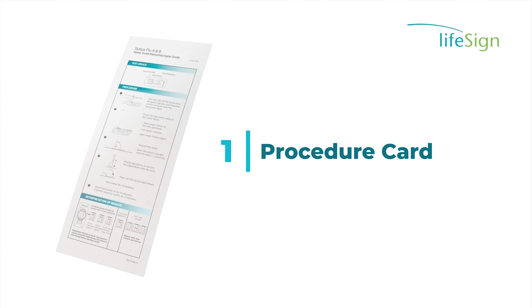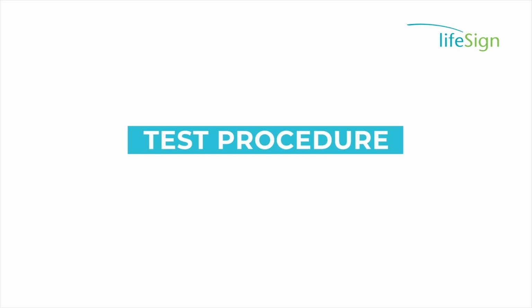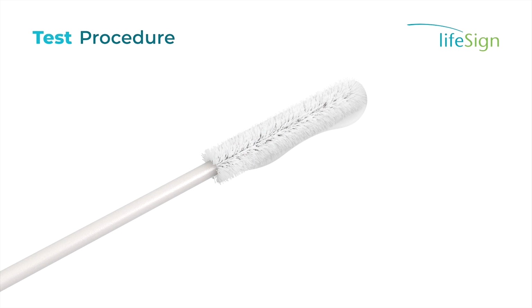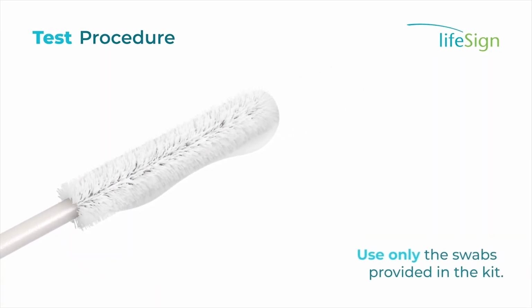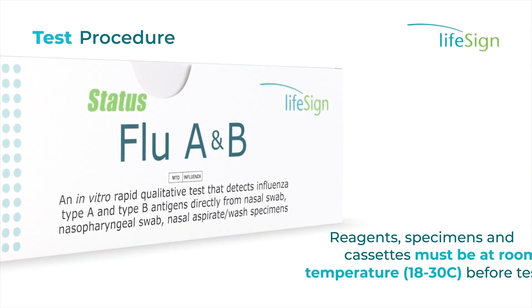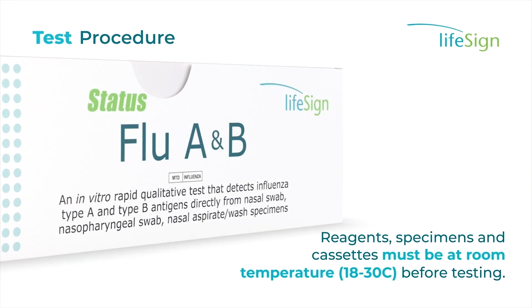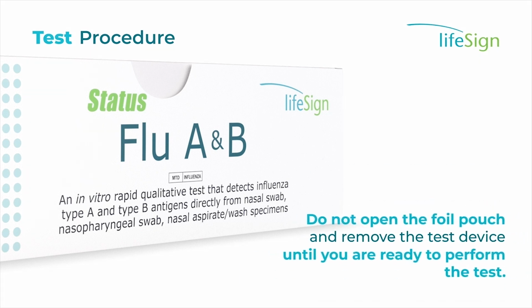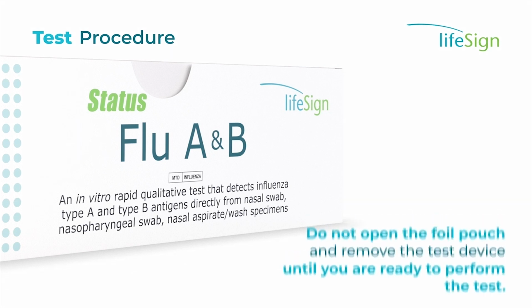Good sample collection is the most important first step for accurate test results. For best results, it is recommended to read the package insert for details on test procedure and external QC before performing a test. Use only the swabs provided in the kit. Reagents, specimens, and cassettes must be at room temperature, 18 to 30 degrees Celsius, before testing. Do not open the foil pouch and remove the test device until you are ready to perform the test.